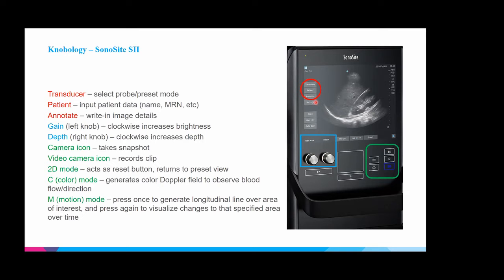And then notice this is just, I got this from the Sonosite website. It's just the liver and kidney. We'll get into what we're seeing here. The depth is set to 16 here, right? And normally it'll tell you the time and date, assuming that it's been adjusted correctly.